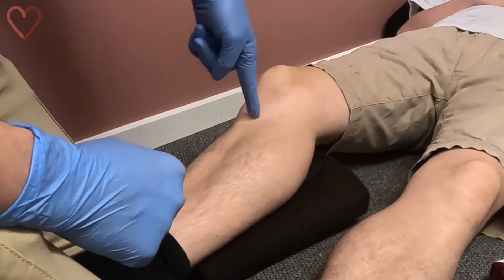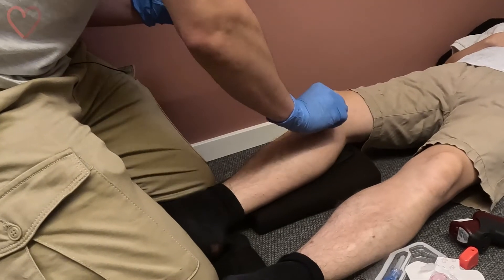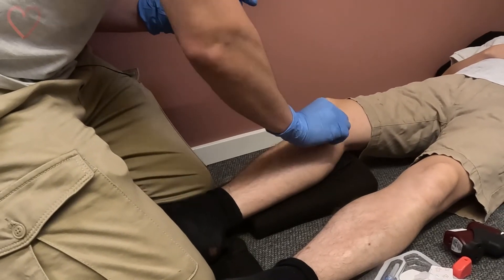That is where you're going to drill straight down. Before proceeding, make sure to clean the area thoroughly.